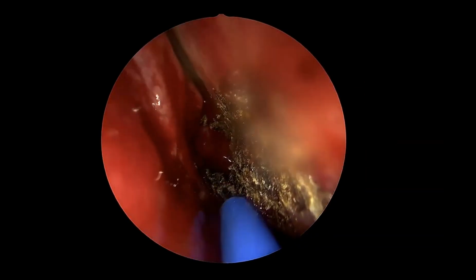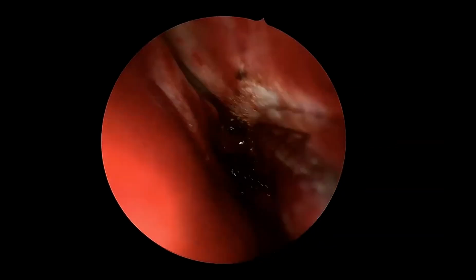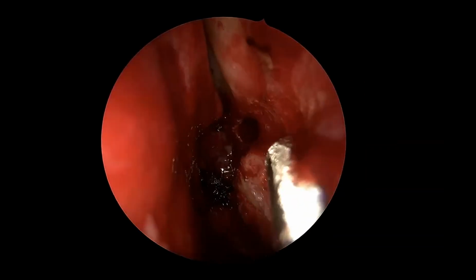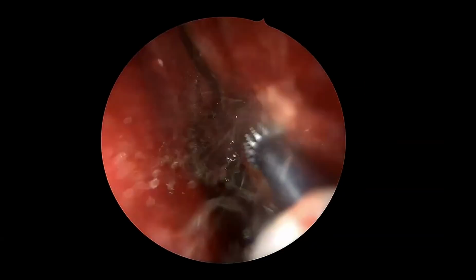This is the posterior septectomy. There are different techniques. I like to cauterize it before I microdebride, just because I think this helps with hemostasis, but it certainly is more of a technique desire than a requirement.